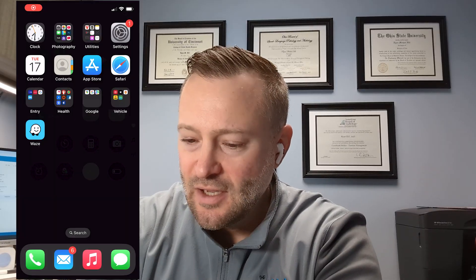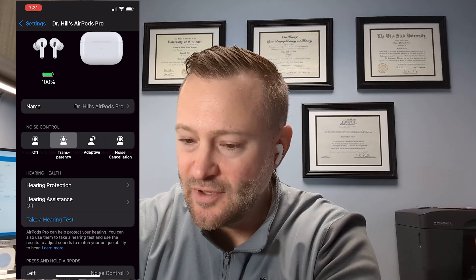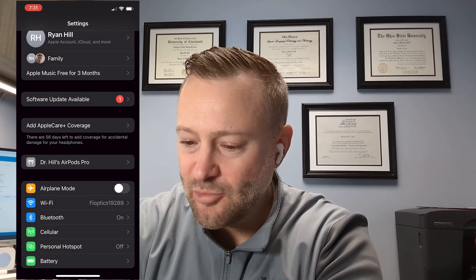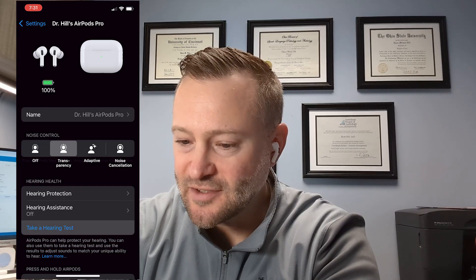As you can see, I have them in my ears — right and left. This is my right, that's my left. And I have my case here. I've already paired these to my phone, but I'm going to start recording my phone and pull it up on the screen next to me. Then we'll get into the settings, and mine are called Dr. Hill's AirPods Pro.